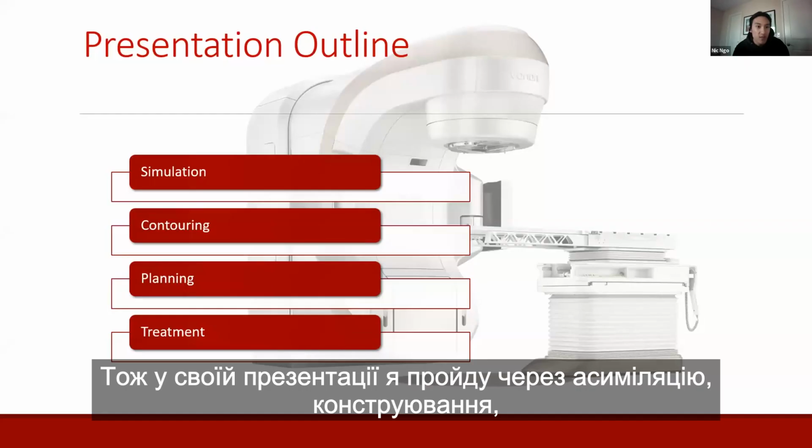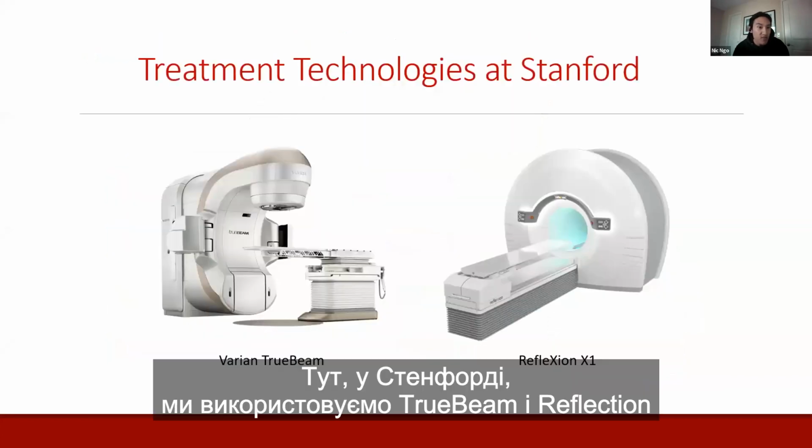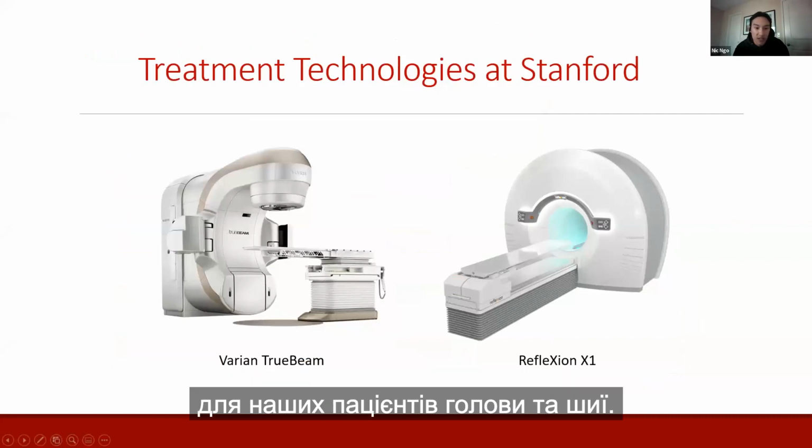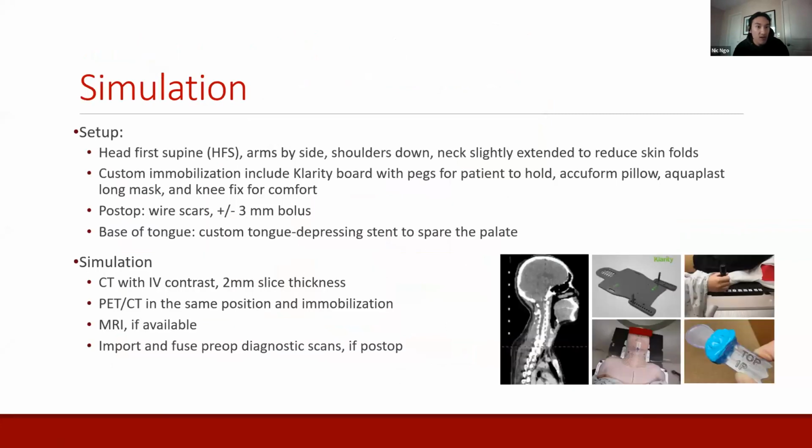So the presentation outline, we're going to go through simulation, contouring, planning, and treatment. Here at Stanford, we utilize TrueBeam and Reflexion for our head and neck patients. We'll get a little more into those later.